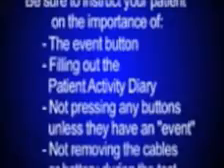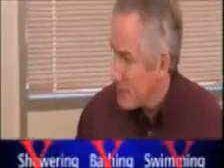Please note that any changes you make in the analysis results screen are saved automatically when you exit the screen. If you perform reanalysis of the current Holter test, any changes you have made in this screen will be lost.